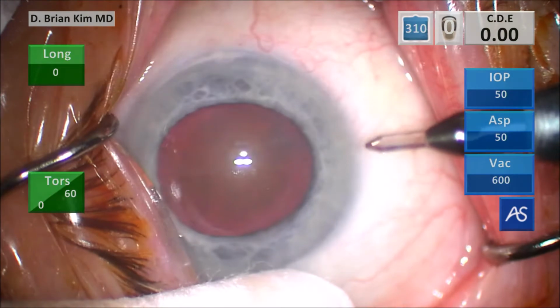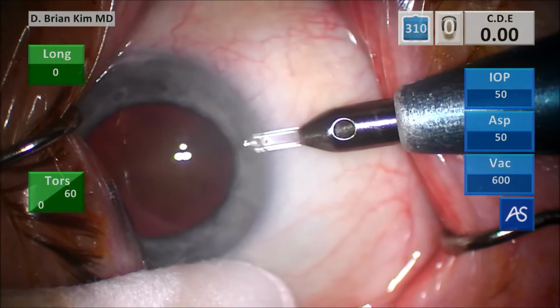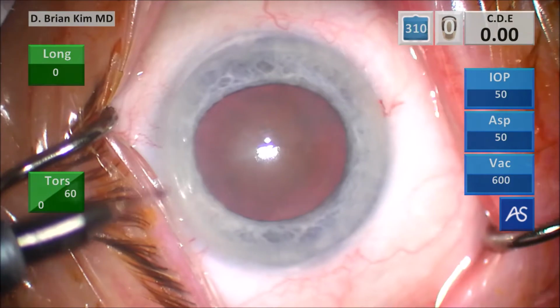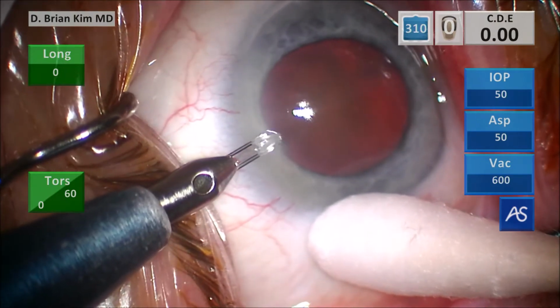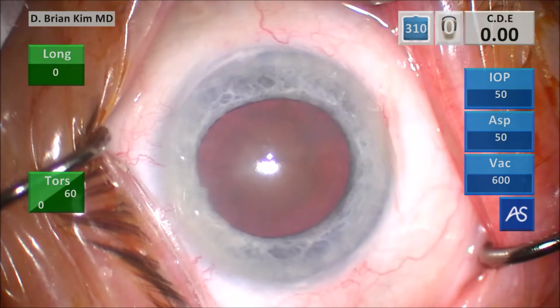And then I'm making paracentesis incisions first on the right side and then the left side. I'm using the cotton tip to control the eye so I can get a nice flat approach parallel to iris plane. And this creates a nice corneal shelf, which will allow me to achieve a self-sealing incision. You can see this is the right eye.